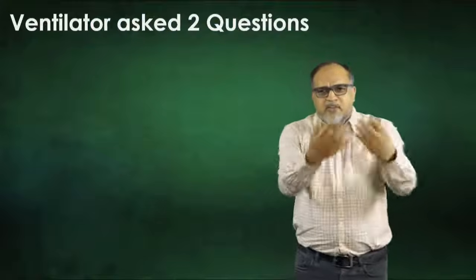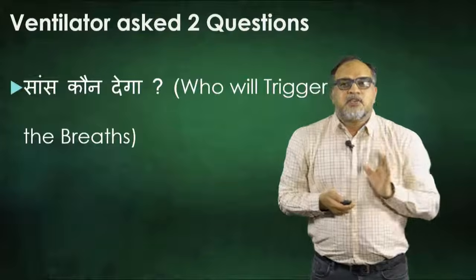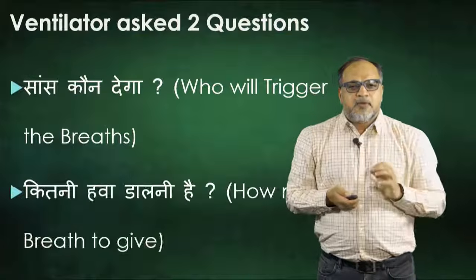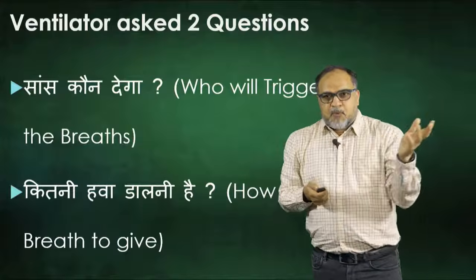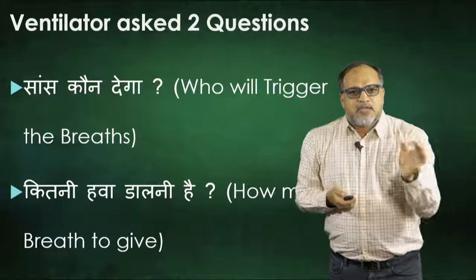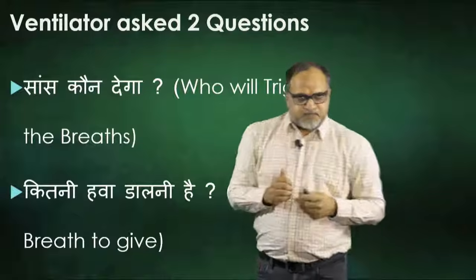Whenever we gave him the patient, he would ask us only two questions. First one was, कि सांस कौन देगा? That is, who will trigger the breaths? And the second question would be, कि कितनी हवा डालनी है? Just that. The ward boy would ask only two questions. सांस कौन देगा and कितनी हवा डालनी है. Right. So let's come to both these things.